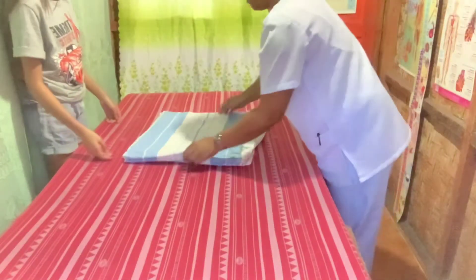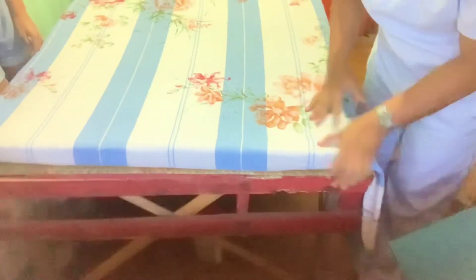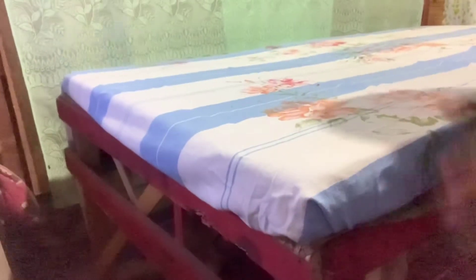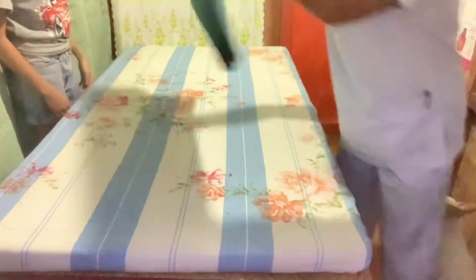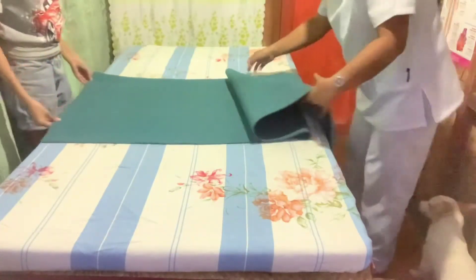Place a bottom sheet on the bed with the center fold at the center of the bed and spread the sheet, tucking it under the head of the bed. Make a mitered corner and tuck the remainder of the sheet under the side of the mattress all the way to the foot of the bed, pulling it tightly to create a smooth surface. Place the plastic draw sheet over the middle part of the bed with the center fold at the center.